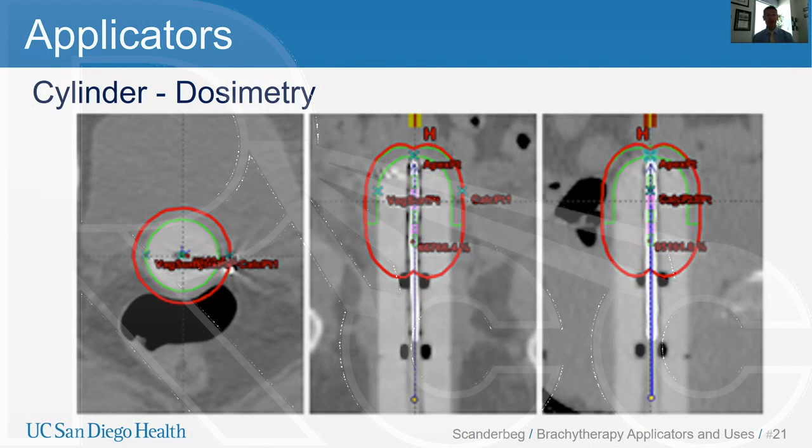Another planning scheme is to use the planning length aim, which is defined as the length of the vagina treated with the planning aim dose. So I believe that's how Adam and the program is teaching for the planning aim dose. But it's very critical to get that idea conveyed to the physician and the team so that everyone's on the same page and the planning is very consistent.